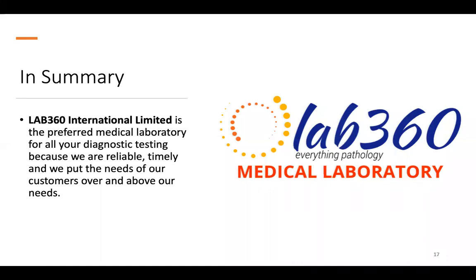We do the activated partial thromboplastin time, which is the APTT. That's for coagulation studies. We do fibrinogen as well. Then obviously, if you move over to clinical chemistry, we do the kidney function test. We've got your electrolyte, urea, and creatinine. We do the liver function test, and that cuts through your total protein, your albumin, your ALT, AST, your GGT. We do the LDH. We do your bilirubins, that's your total and your conjugated.